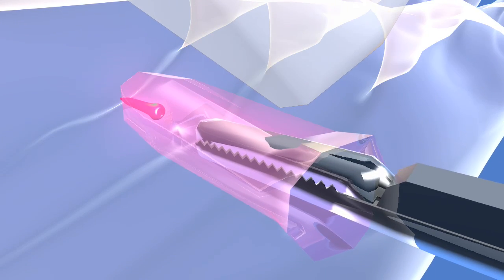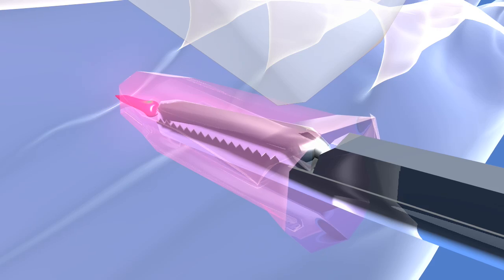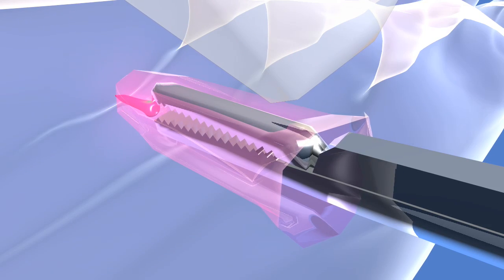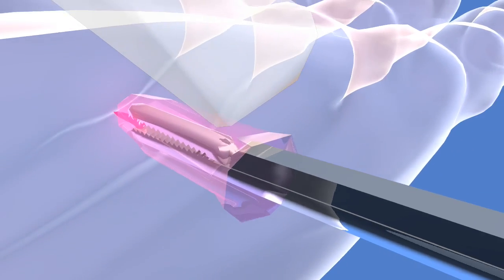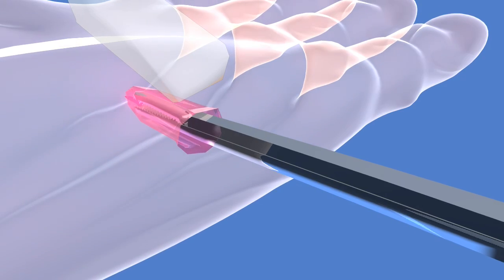Then re-entry of the forceps grasping the foreign body in the vertical plane and removing the foreign body under ultrasound guidance.